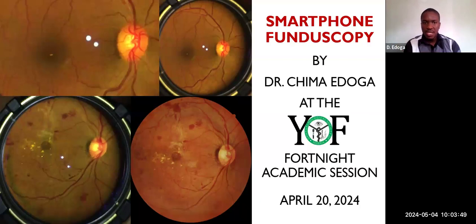If you see this screen I'm sharing, you can see that the optic disc is not overexposed. So it's just perfect. You can see the cup, you can see the rim. Then the other thing is, we now begin to adjust the focus. And remember, you have to be recording when you are doing all these things, so that at the end of the recording, you can go and take screenshots of the clearest and the sharpest image.